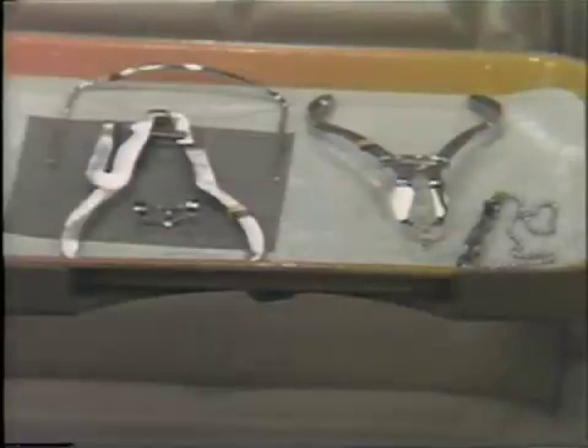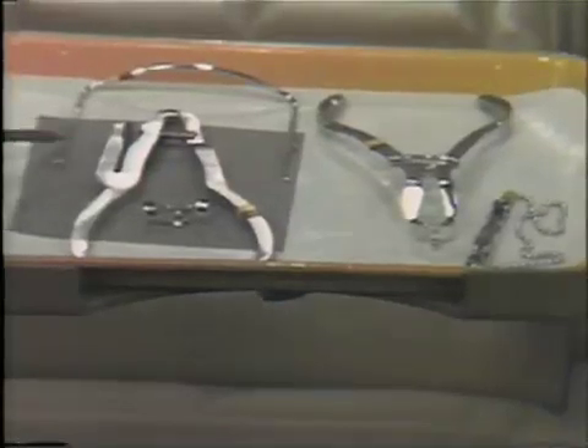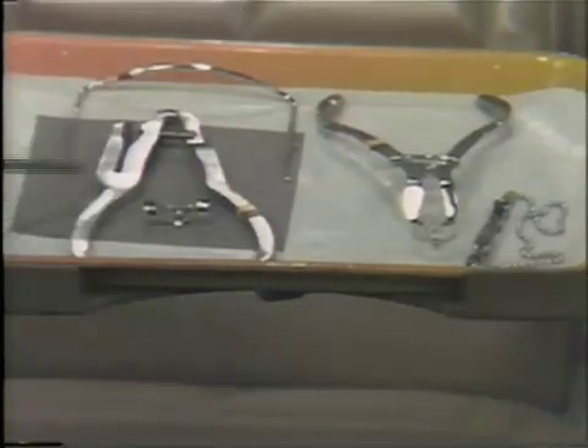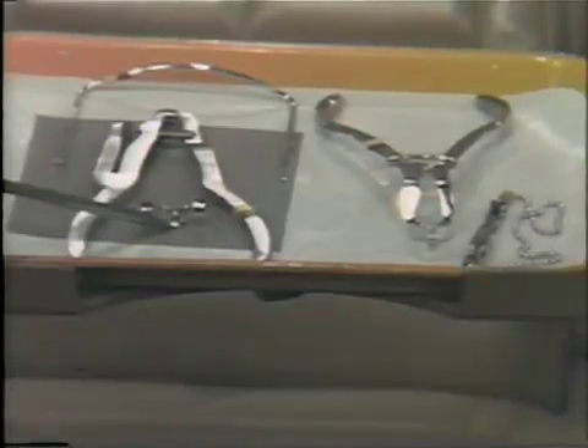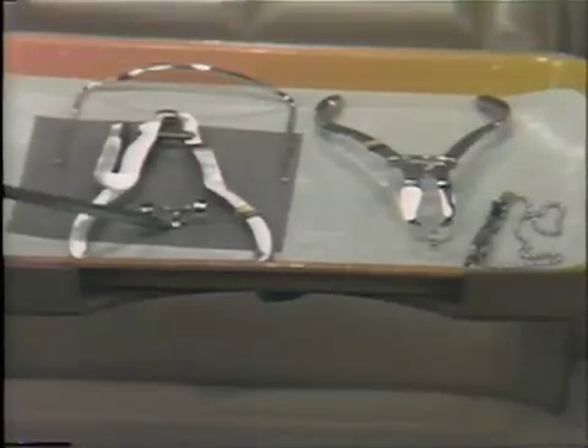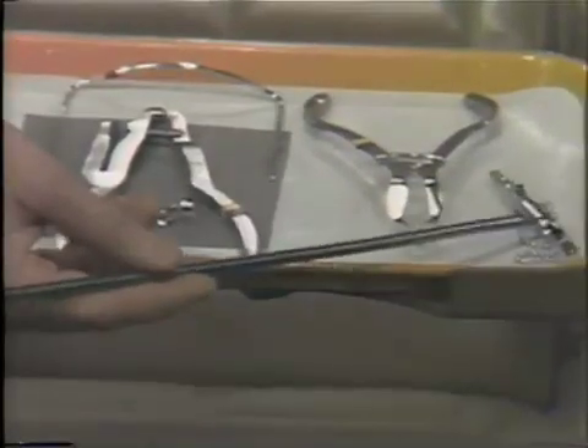If we go directly to the bracket table, the only thing we would like to see on a bracket table prior to the entry of the patient into the chair are just those items for placing a rubber dam. Let me point these out: the rubber dam frame, the rubber dam, the rubber dam punch, that rubber dam clamp necessary for that particular tooth, the rubber dam forceps, and of course, the napkin chain.